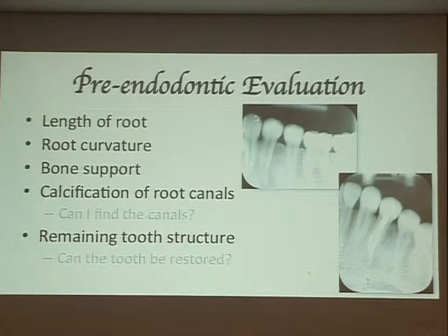Whether the remaining structures allow me to restore the tooth. A lot of colleagues save the root, but however, the root cannot be restored. There's no point spending a lot of resources, including money, time, and patient expectation on our side, to treat a tooth that's hopeless. So in this case, it's two canals. If you ask me, I don't want to do it, but the patient has the problem. And we know that this lower premolar is very popular in our Asia. So I have to do this.